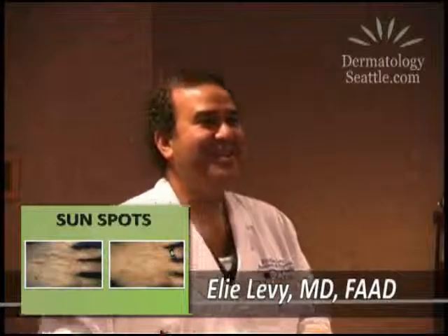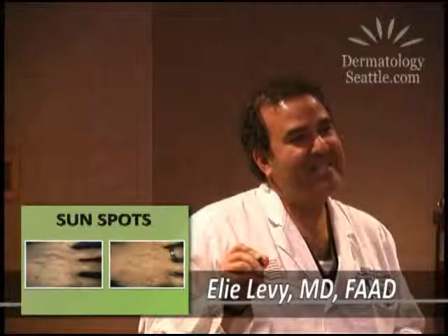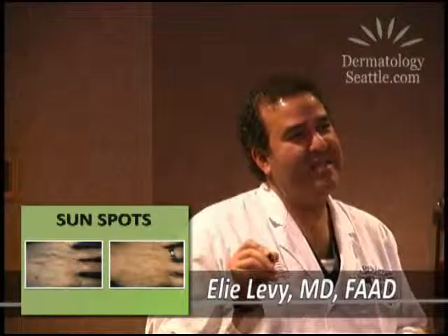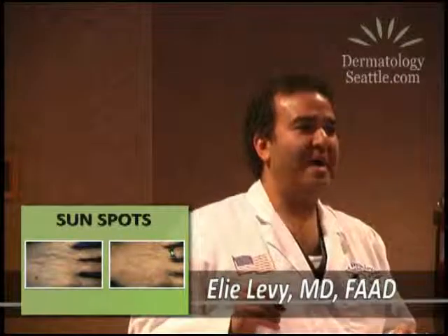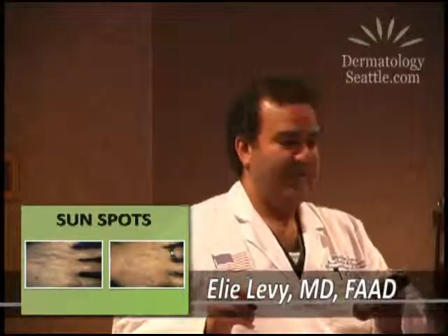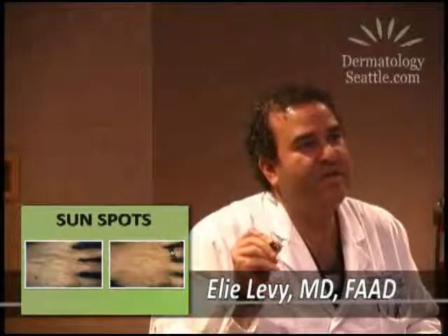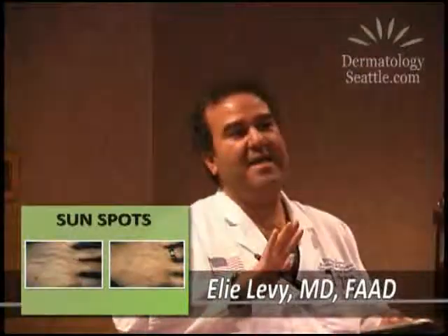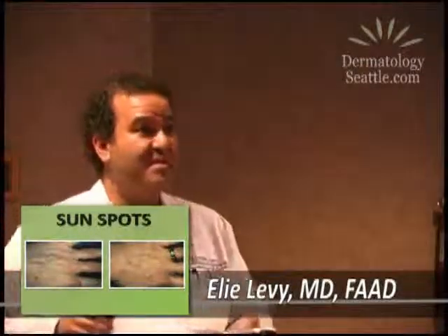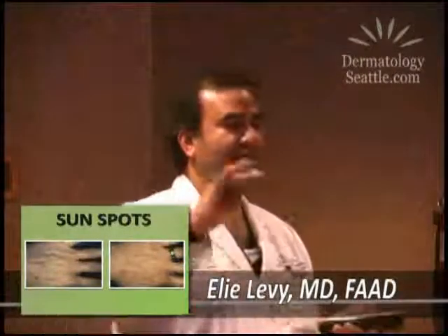And you can see over here, here's after one treatment, you can see how a little bit streaky it is, because we have to apply the laser kind of in a linear pattern. Do you see that? Kind of like the little streaks right there. So what we do after that is, let me go back, right there, we treat the other way the next time. We treat in that direction, and then it kind of neutralizes that pattern. So about 3 treatments, and really, I never saw her back. All her freckles went away, generally on clean skin.